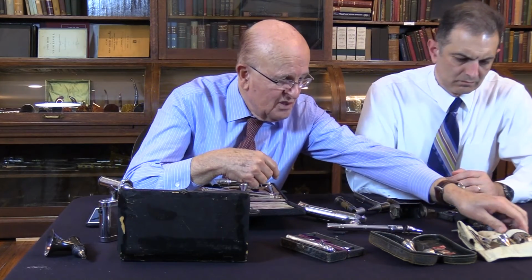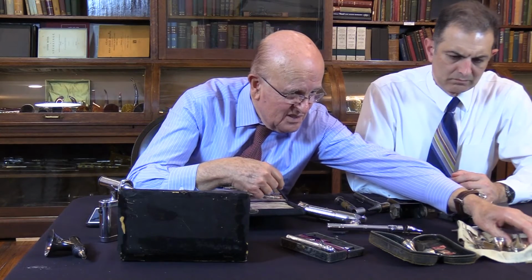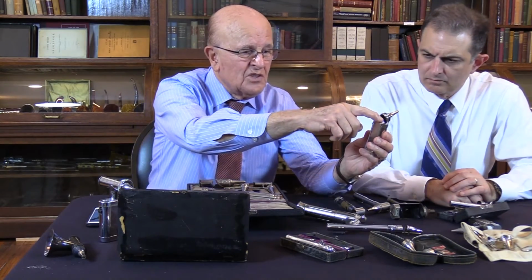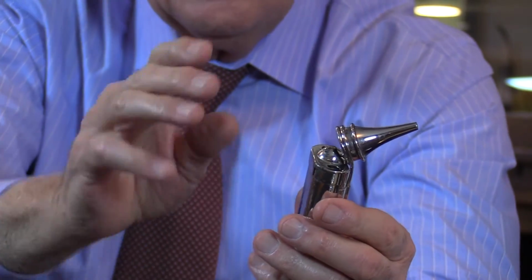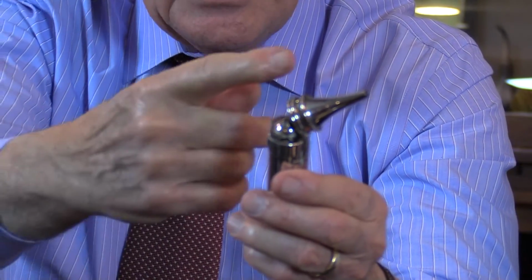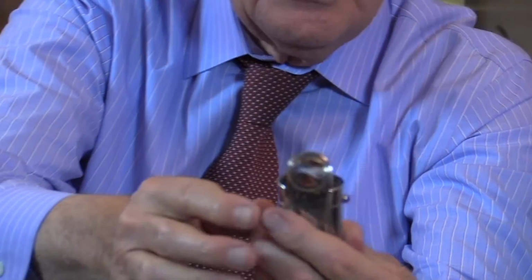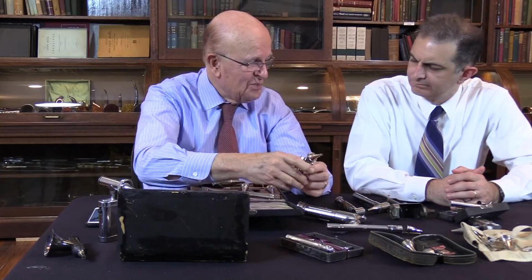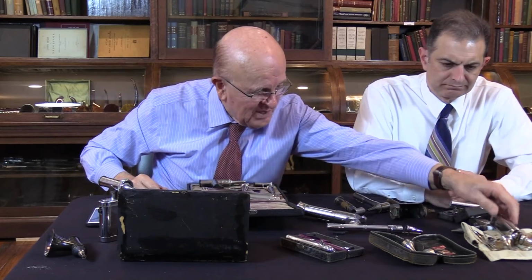One more interesting otoscope is this here, where the light bulb is here. But again, they did not solve the issue of having the axis of vision and the axis of light. And as you can see, if you try to look here, half of the view is obstructed in the way here. But that's how they developed, one step after the other.